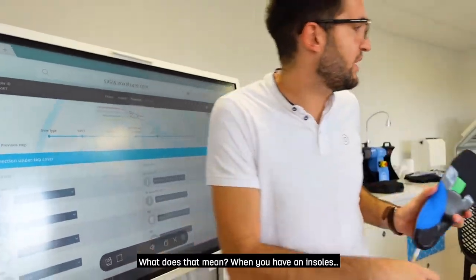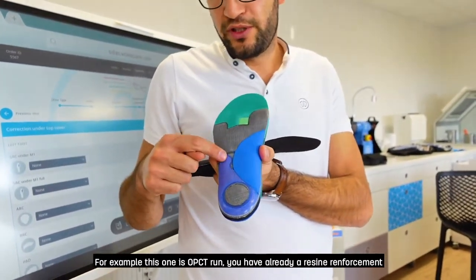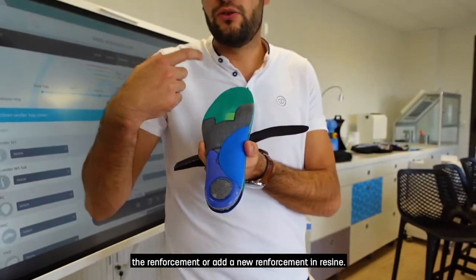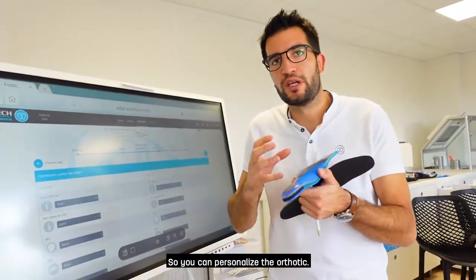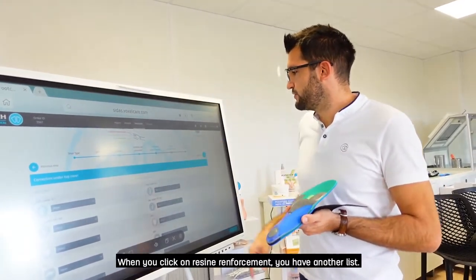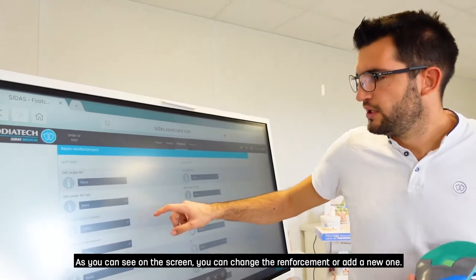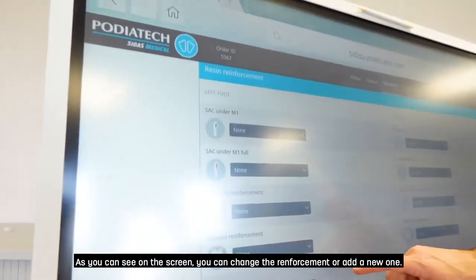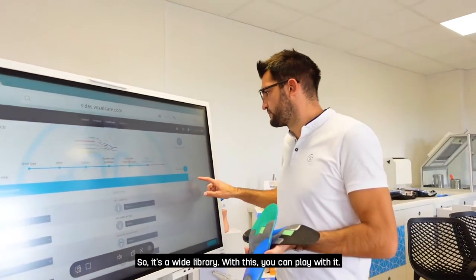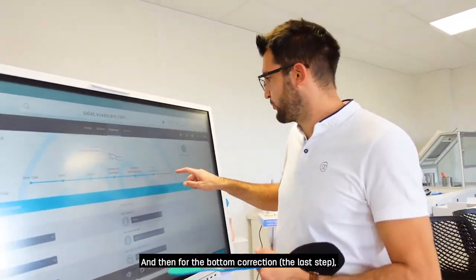The third category is Resin Reinforcement. An insole like Opacity One already has a resin reinforcement, but you can change the reinforcement or add a new one in resin. When you click on Resin Reinforcement you have another wide list — you can change the existing reinforcement or add a new one. The library is wide and you can play with it.